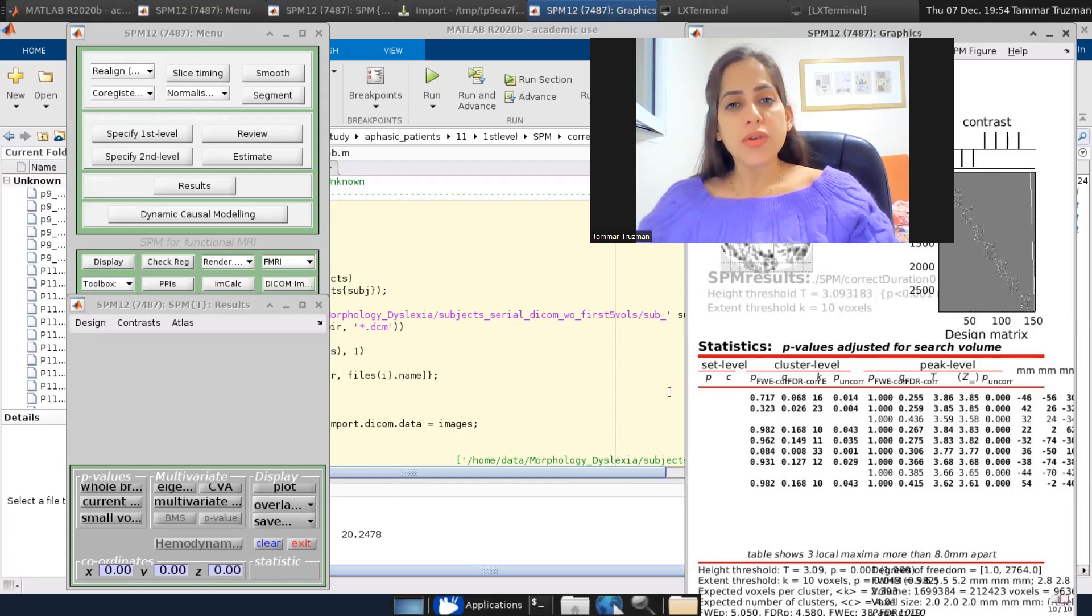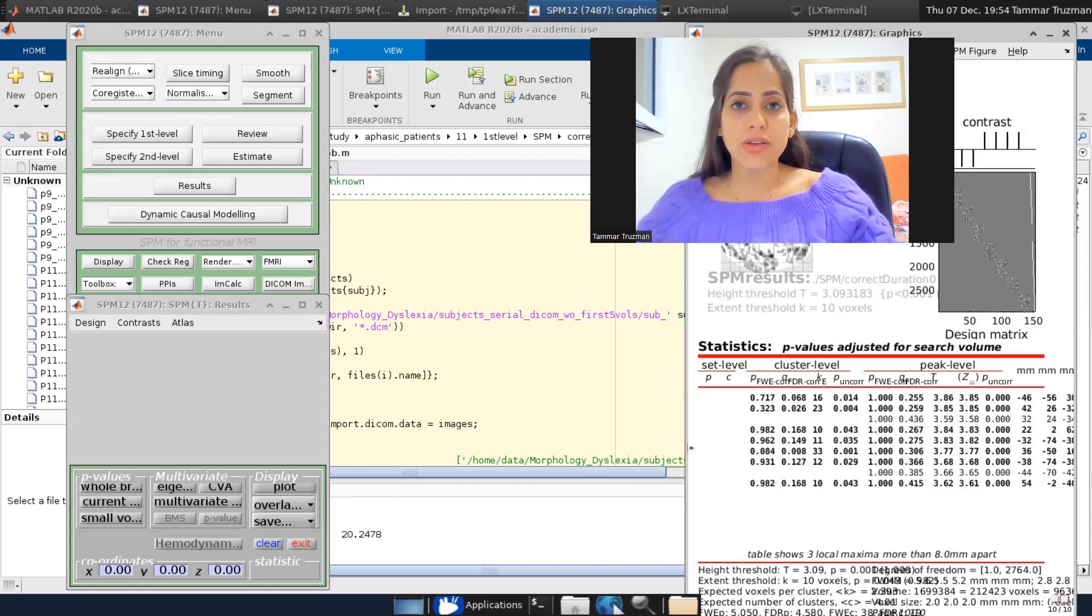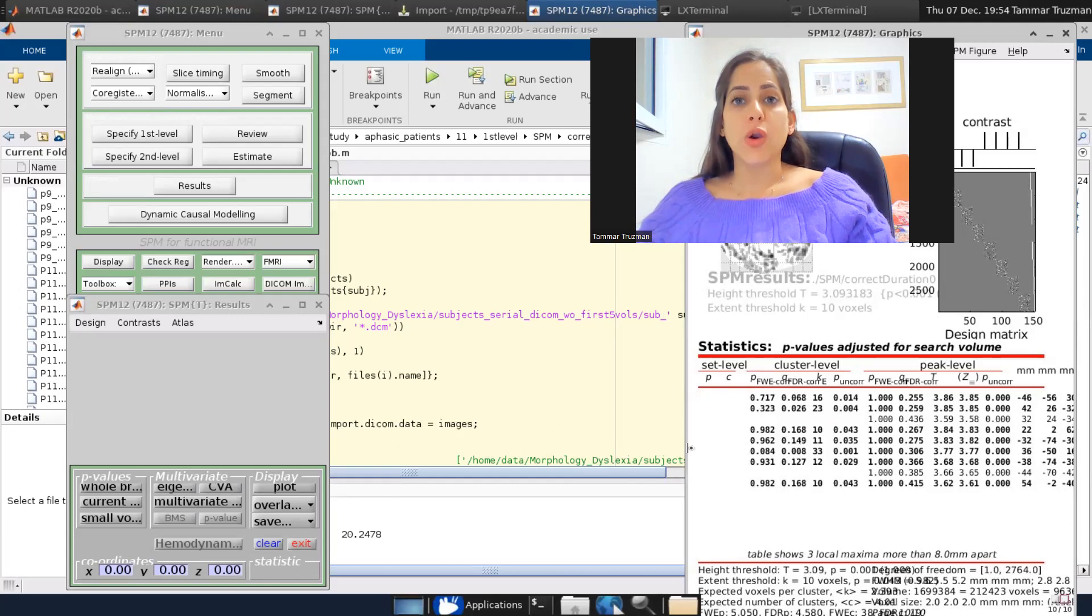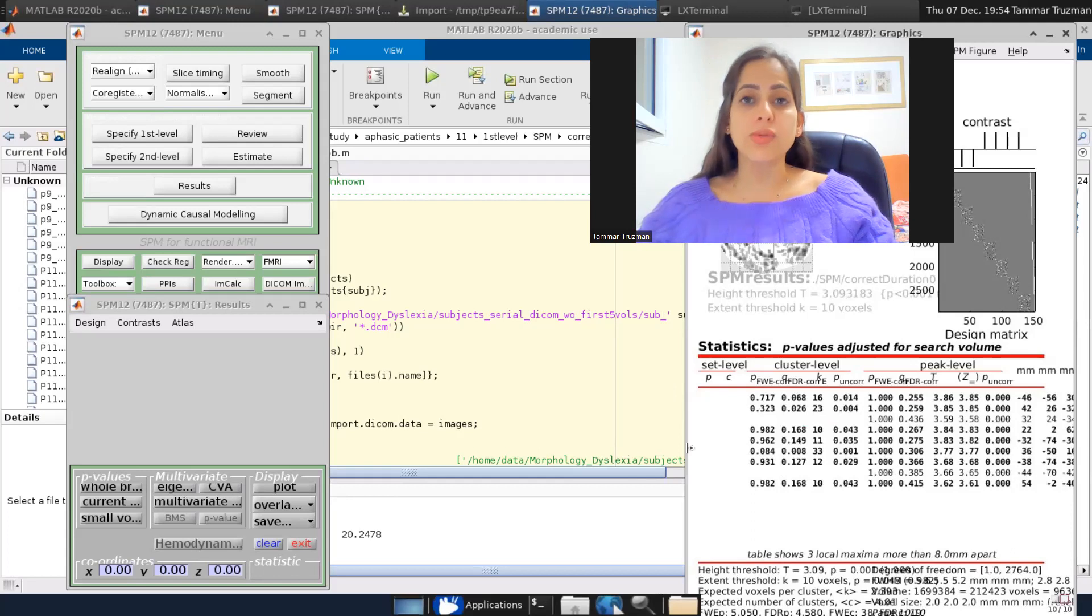Now we are looking for the family-wise error, the high threshold T that corresponds to correcting only for the voxels within our VOI. This is what we want to search for.